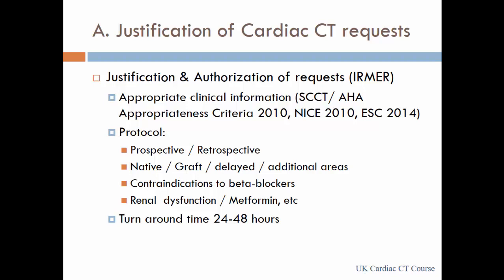But it's good information, because we can call the patient, or ask the referring cardiologist to prescribe oral steroids to the patient beforehand, from a day before or so, so the patient comes prepared. Or we can give some intravenous hydrocortisone before the scan starts. So there are certain things one can be prepared for if we know there are any contraindications to the drugs we're going to give.